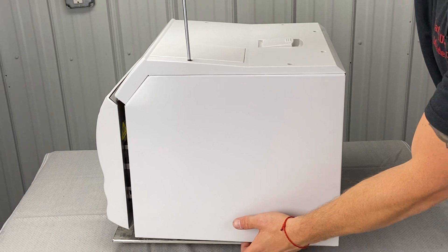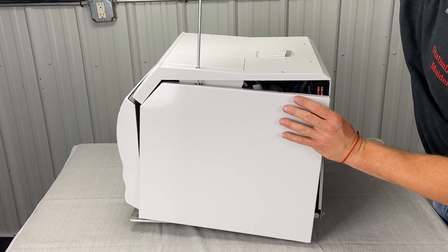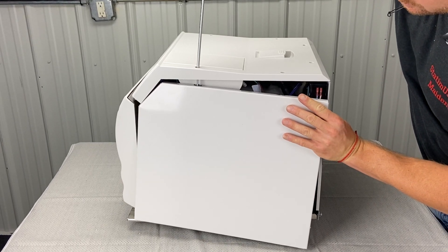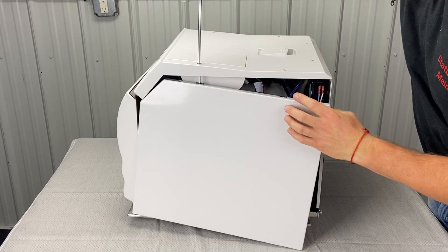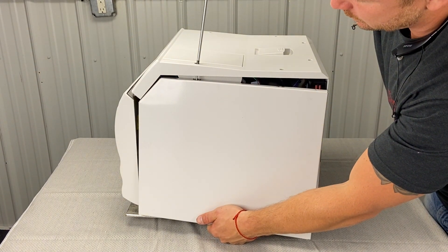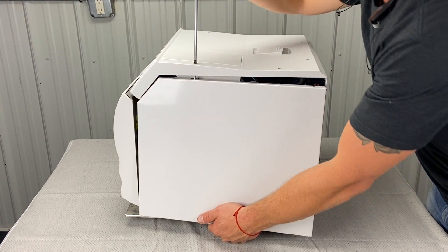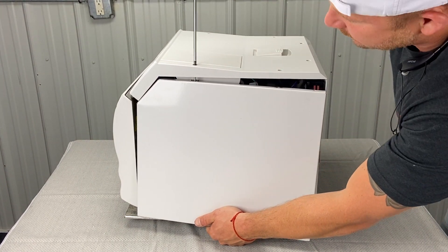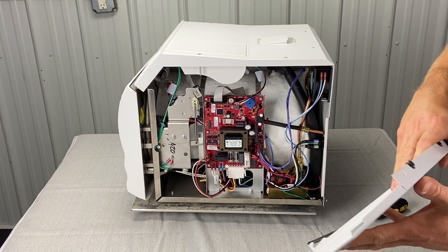The bottom panel fell off down there. Sometimes they can be difficult to get off — this one's working its way out. It's usually not that difficult, honestly. After a brief struggle, there we go — finally got it.